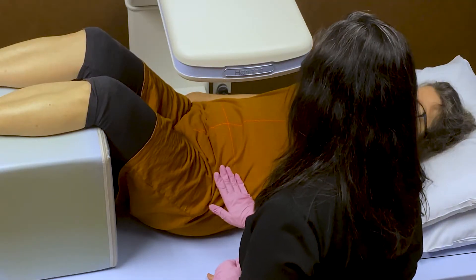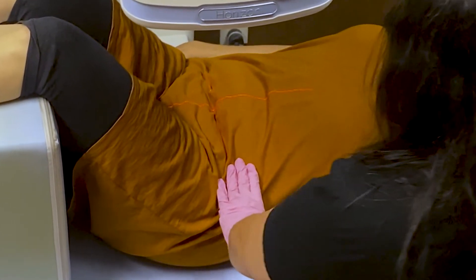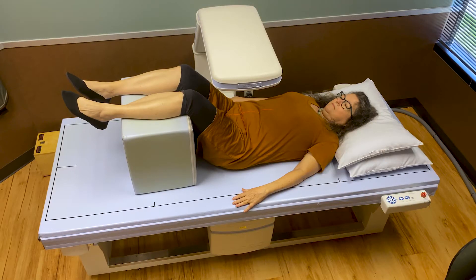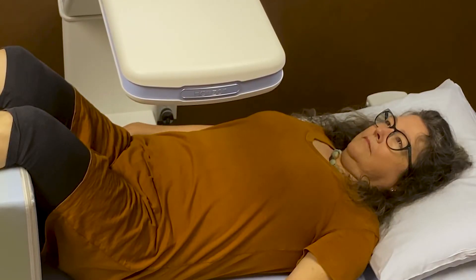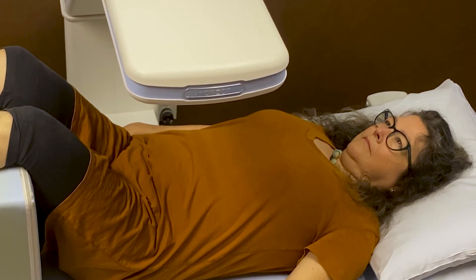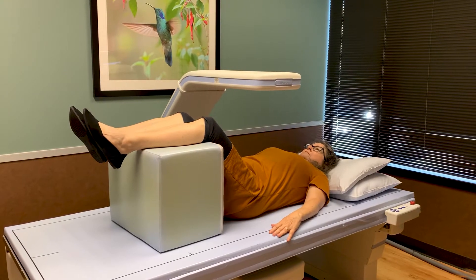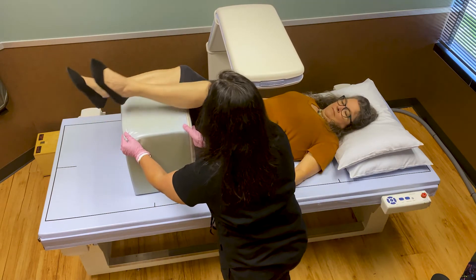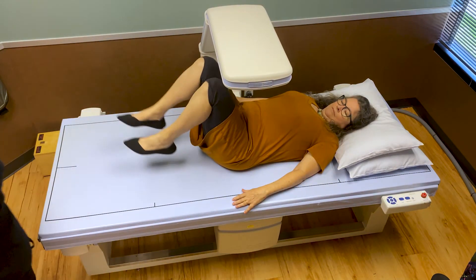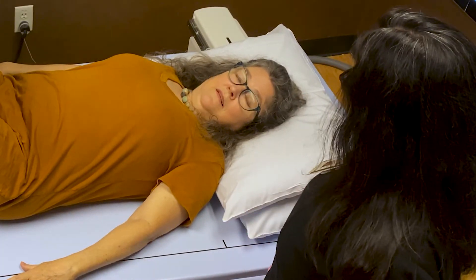Now I'm going to touch you on the side. All right, we're going to get started. All right, I'm going to go ahead and take away the cushion. So that's it — you're all done.